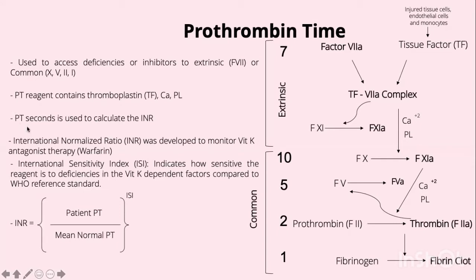Then the prothrombin time, or the prothrombin seconds, which we calculate after adding the reagent to the patient plasma, we will use to calculate what we call the INR.